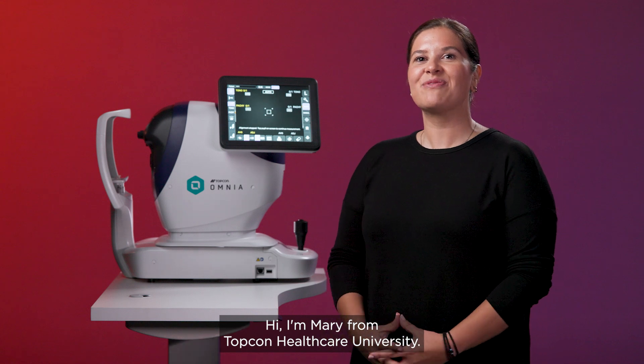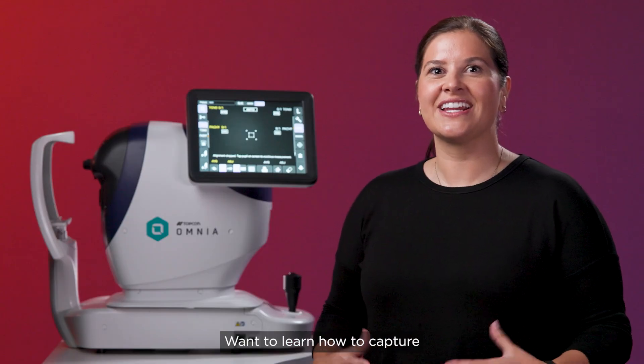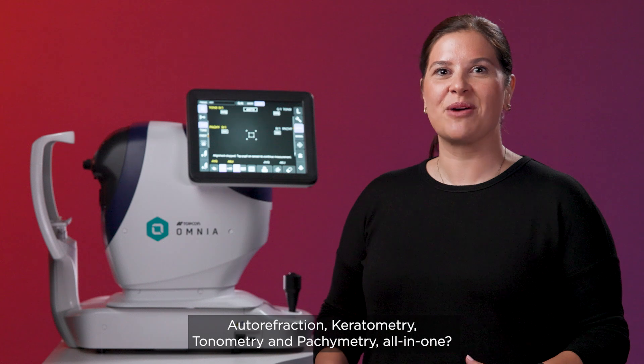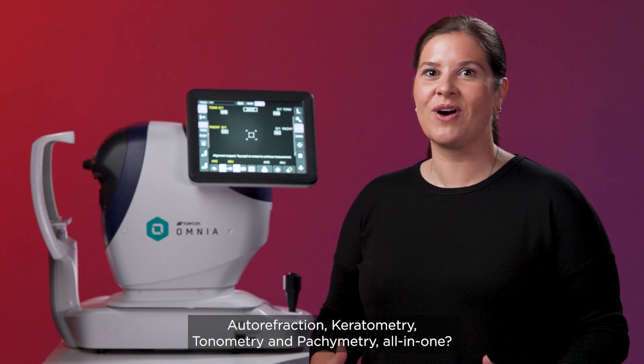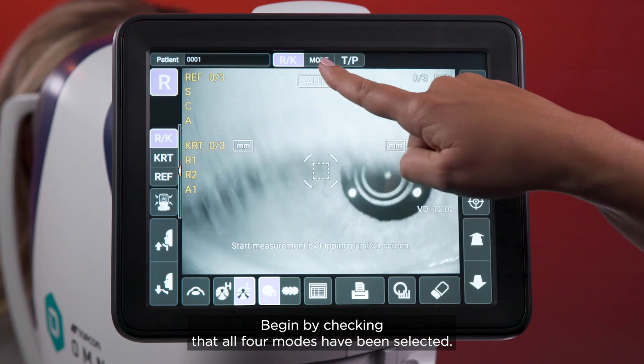Hi, I'm Mary from Topcon Healthcare University. Want to learn how to capture autorefraction, keratometry, tonometry and pachymetry all in one? Let me show you how.